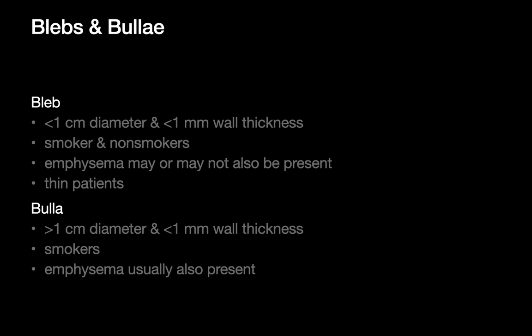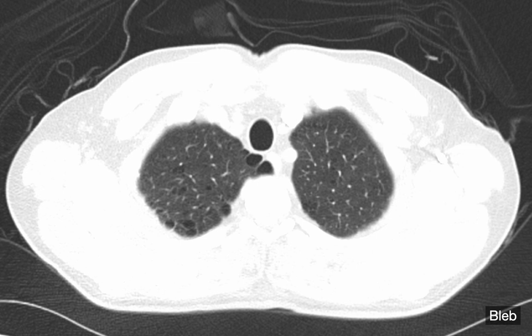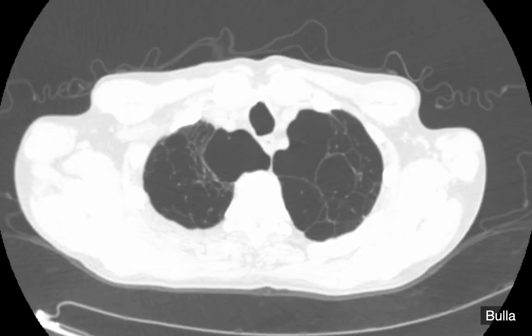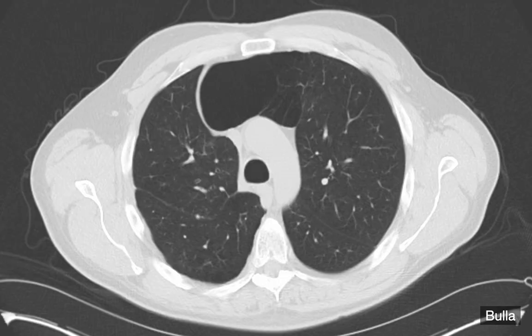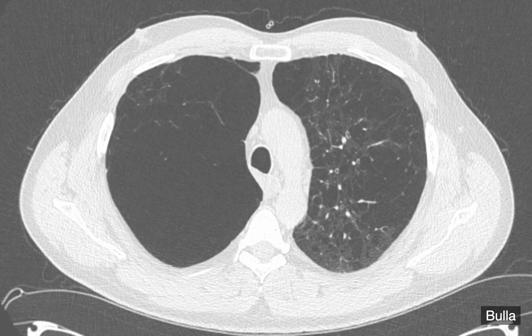The population with blebs is somewhat broader. You'll see nonsmokers with blebs, whereas bullae are generally not seen in nonsmokers. For example, blebs are not uncommon in younger, thin patients. CT examples show superficial blebs just beneath the visceral pleural surface, and cases of large bullae as well.